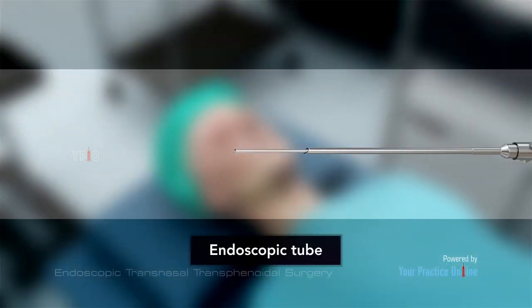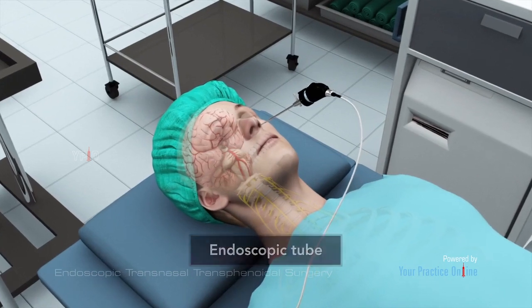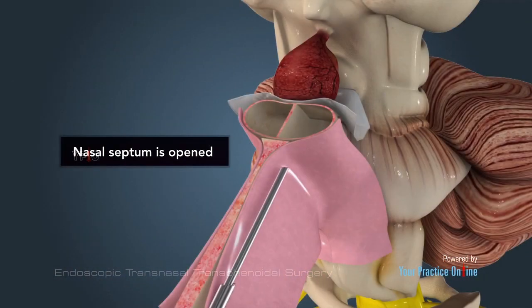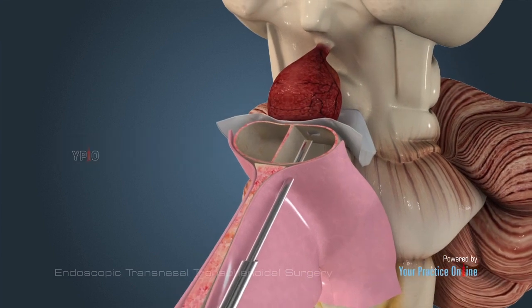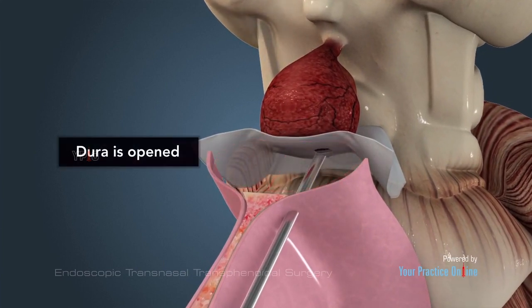A thin endoscopic tube attached to a lighted device and a video camera at its end is inserted through one nostril and moved up to the back of the nasal cavity. A small portion of the nasal septum, separating the two nostrils, and the wall of the sphenoid sinus is opened. The surgeon then makes an opening in a thin bone overlying the pituitary gland, called the sella, to view the dura, the covering of the brain. The dura is then opened to view the tumor and pituitary gland.